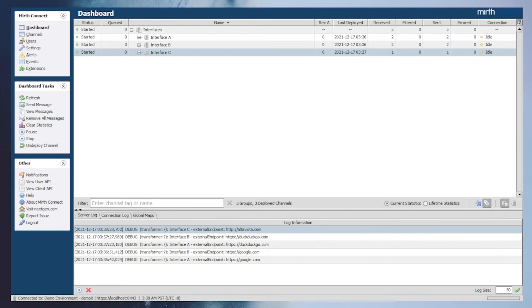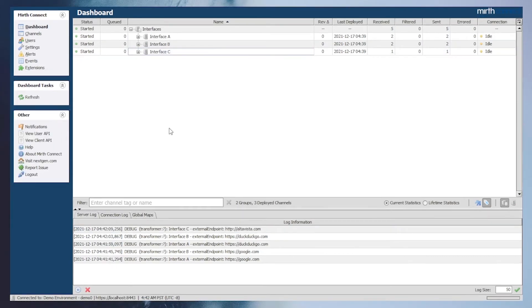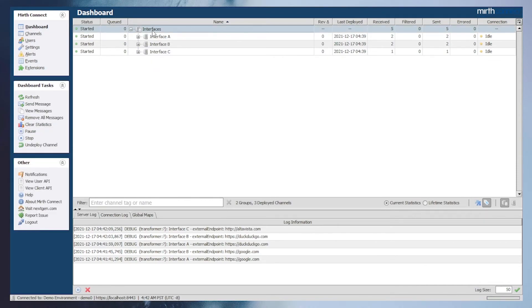Finally, we'll mock up a quick server migration demonstrating that a fresh set of imported interfaces and an imported configuration map backup file will have the interfaces acting as expected without any edits to the interfaces.